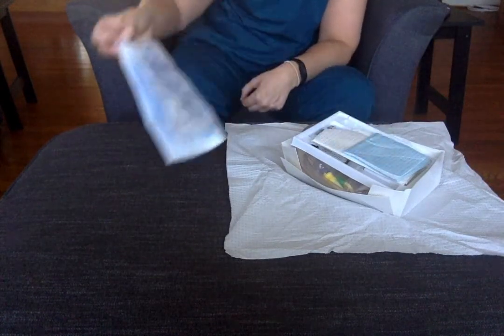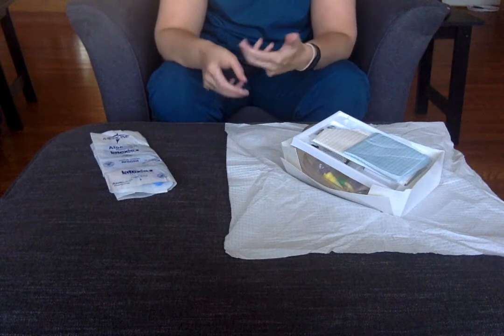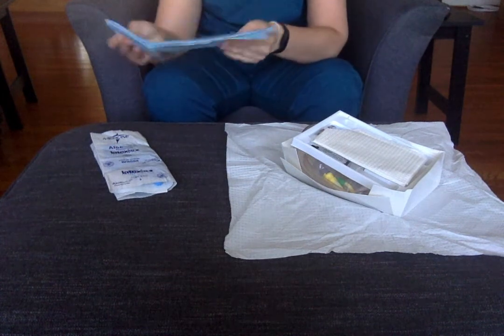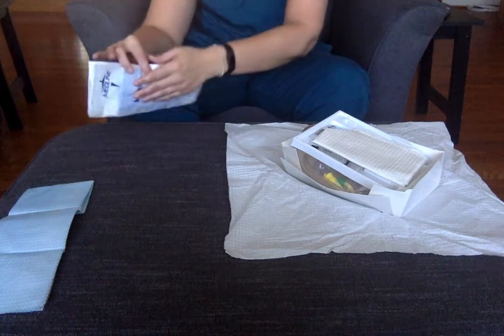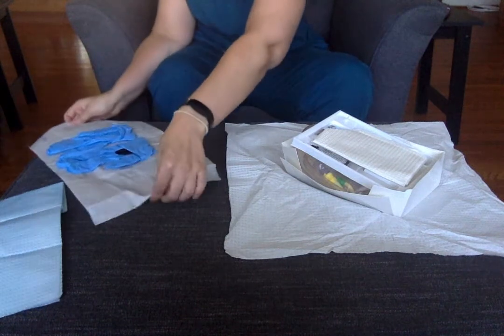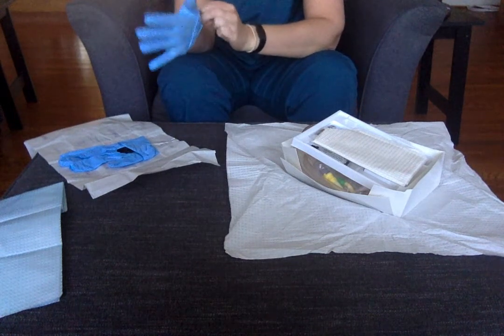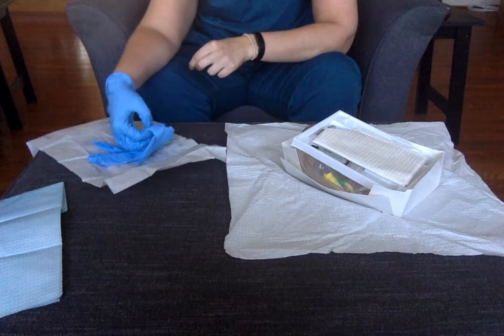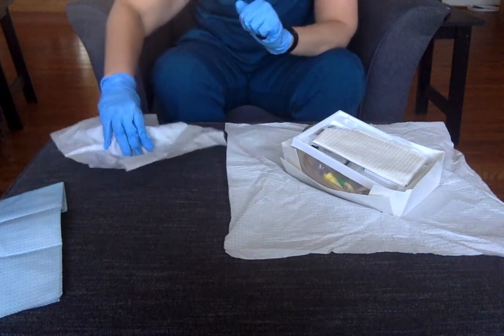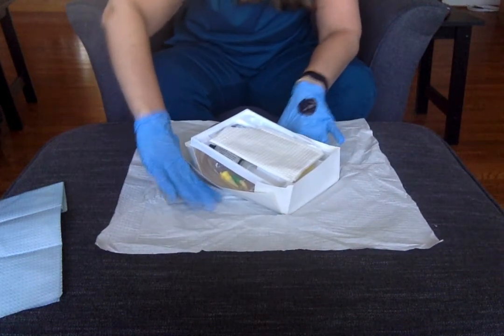I can grab my sterile gloves out of the kit. Normally you'll put the drape and the fenestrated drape on while you're sterile, but for your checklist they say you can go ahead and take this out, be careful not to touch anything else, and go ahead and drape your patient. I'm going to put my sterile gloves on — make sure it doesn't touch your other sterile field. I can touch the inside of the cuff here, grab underneath the cuff to slide my hand in. I can touch the inside of this package to move it. Notice how I'm touching the middle of my sterile field.